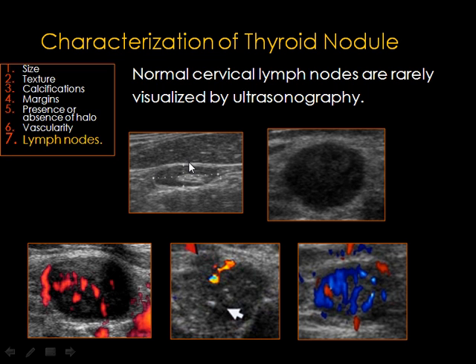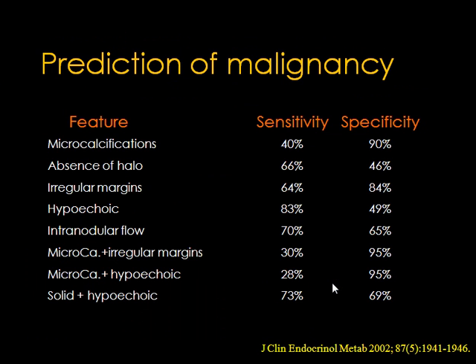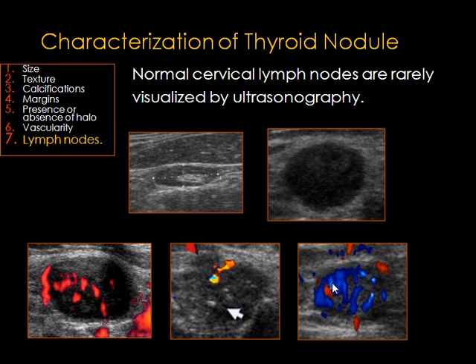small vessels. Malignant lymph nodes have different manifestations. It can be more round or heterogeneous structure, commonly hypoechoic with a loss of hilum, sometimes with cystic degeneration or calcification. On color Doppler, it shows increased flow, peripheral or disorganized flow. However, fine needle aspiration still remains the most promising tool for confirming or excluding malignancy.